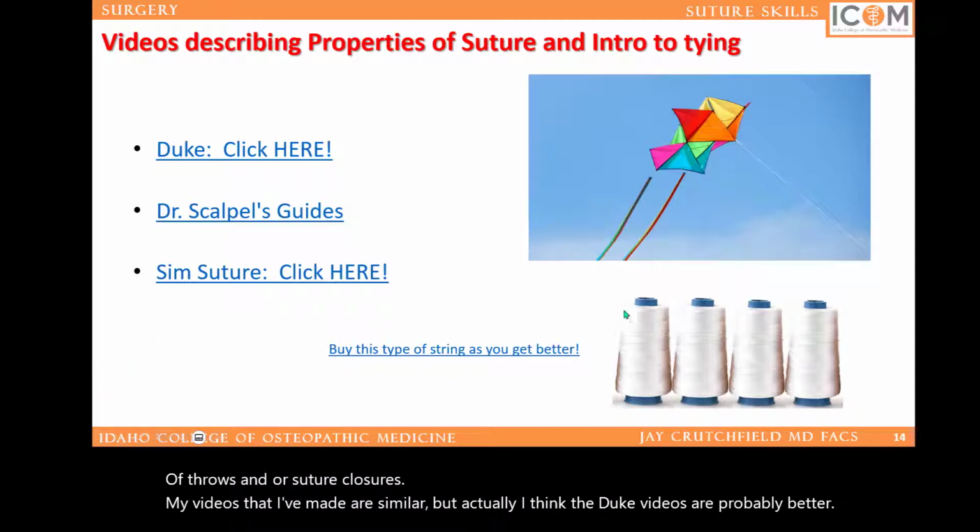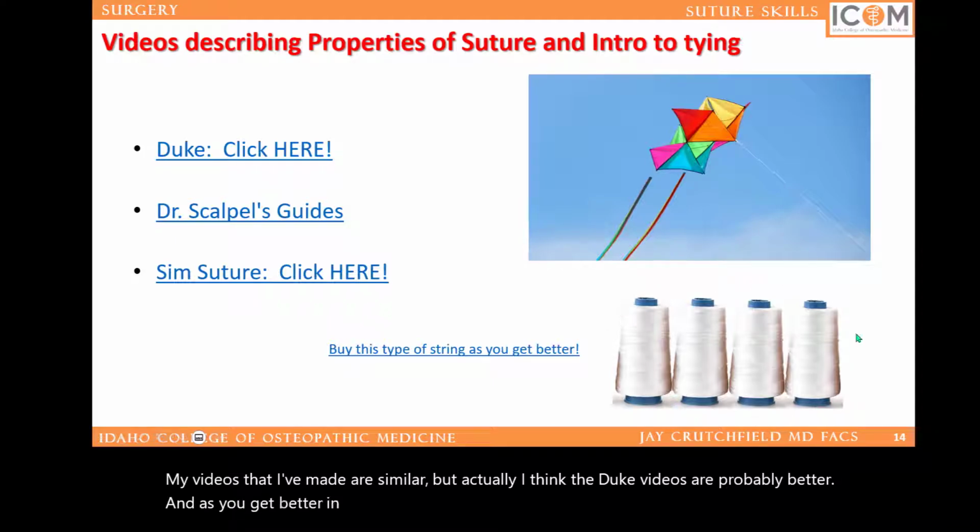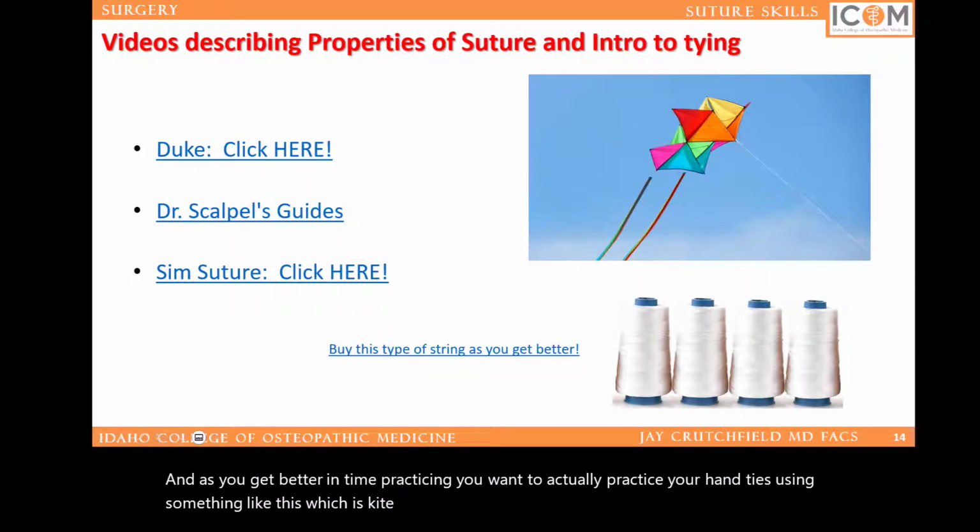And as you get better in time practicing, you'll want to actually practice your hand ties using something like this, which is kite string, hence the reason the picture for the kite.